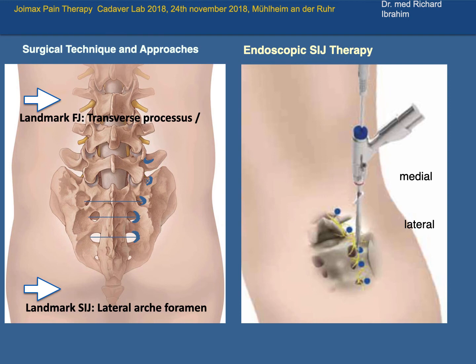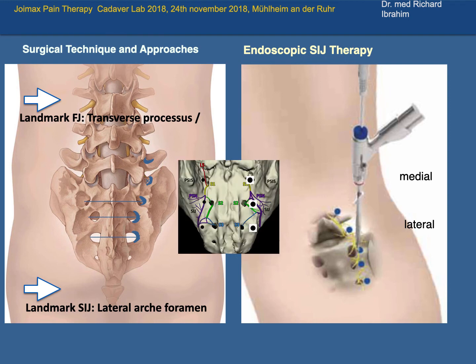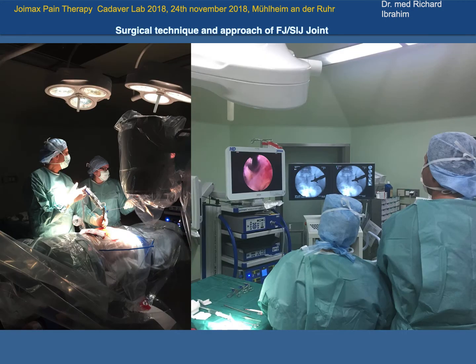So if you know from the picture I showed you before where are which structures, you must keep in mind where are the specific nerve roots and where are the posterosacral networks. That means especially on S1 you should do a lot of coagulation around this area to get the full area of the PSN. So this is how I work.